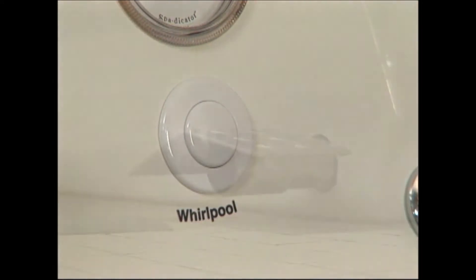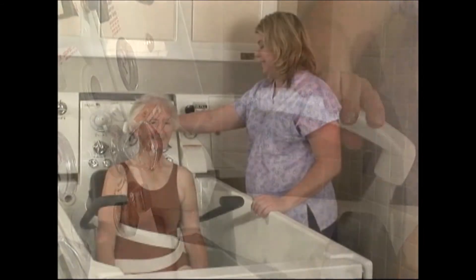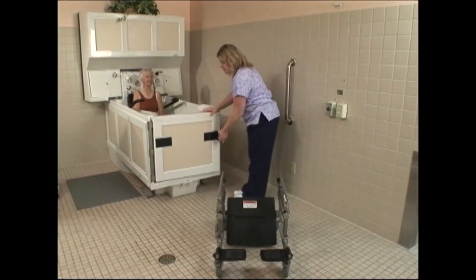When you're done with the bath, turn the whirlpool motor off and step on the drain pedal to empty the water. As the tub drains, this is a good time to wash the resident's hair using the shower wand to keep them warm.